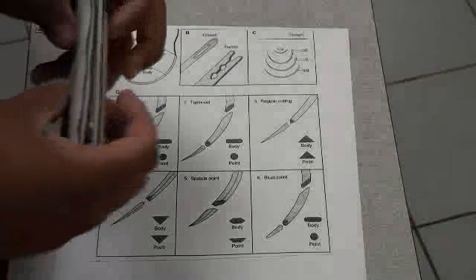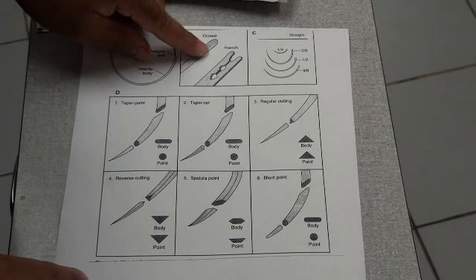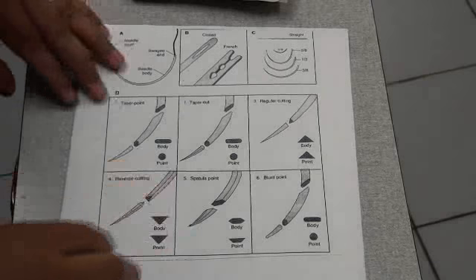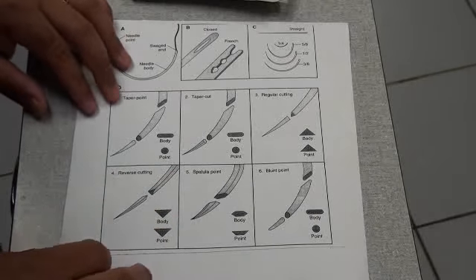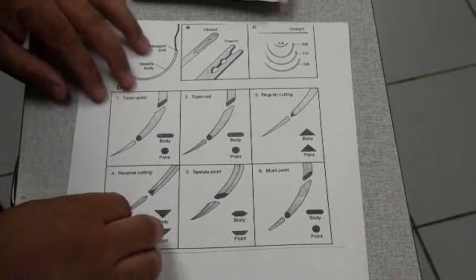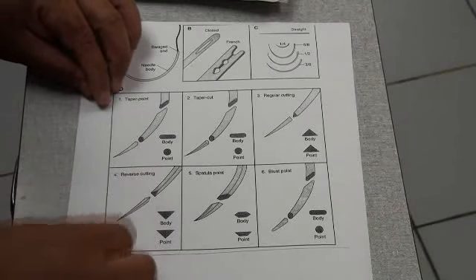One problem with that is that the point where the suture goes into the needle tends to be larger than the needle itself, so it becomes a point where, when you're inserting the needle through the tissue, it can catch there and cause a little more trauma to the site as you're passing through.